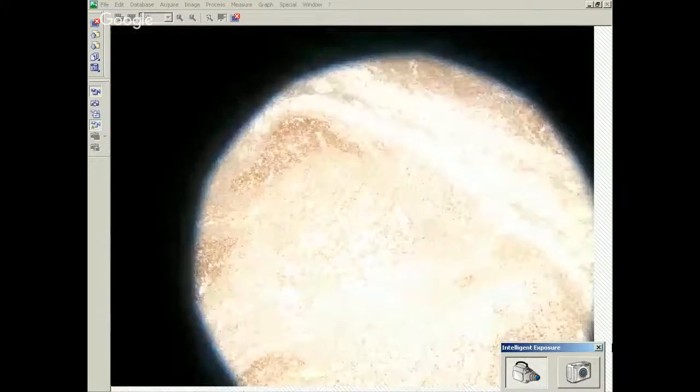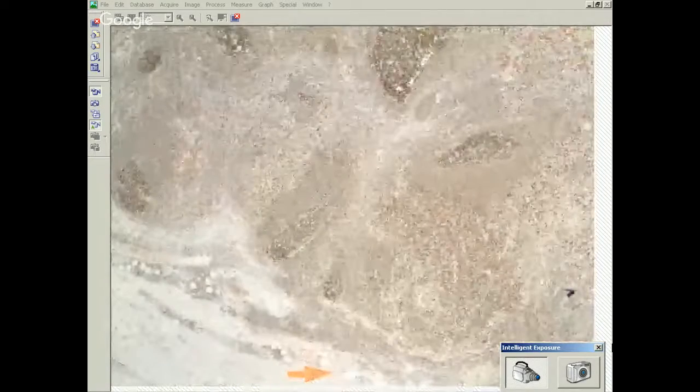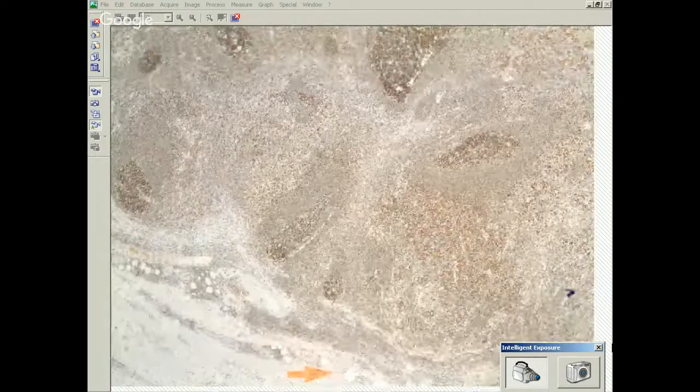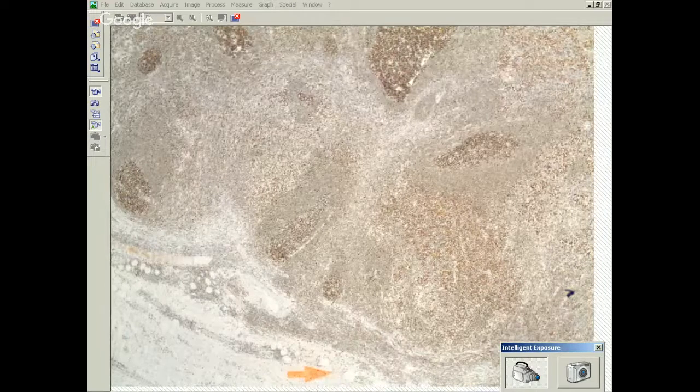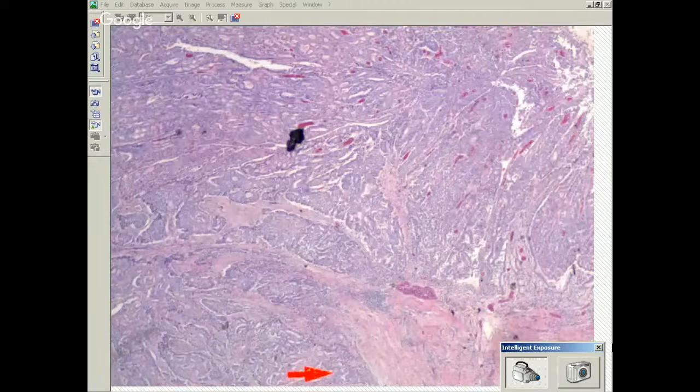So this is an EBV associated medullary carcinoma. These tend to happen in elderly patients, and they're actually, stage for stage, a better prognosis than a regular adenocarcinoma. I happen to bring another one. This is another medullary carcinoma.